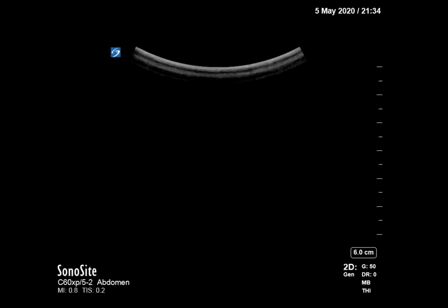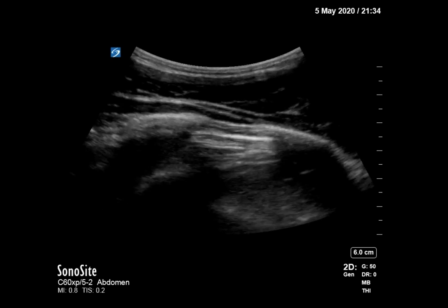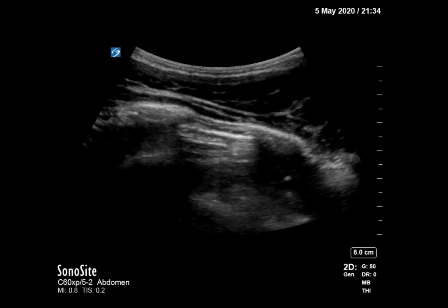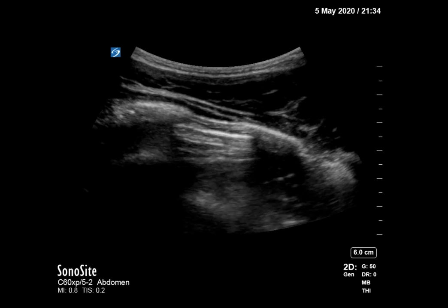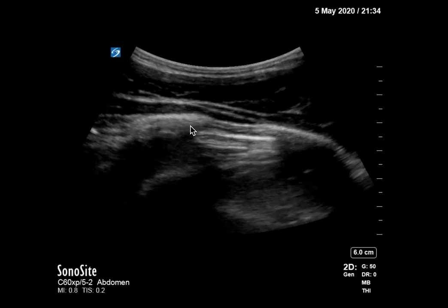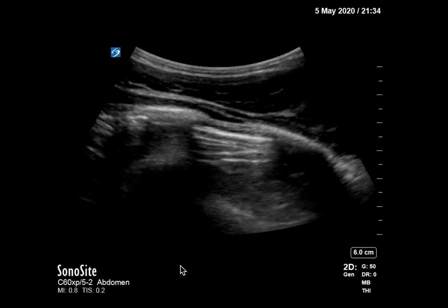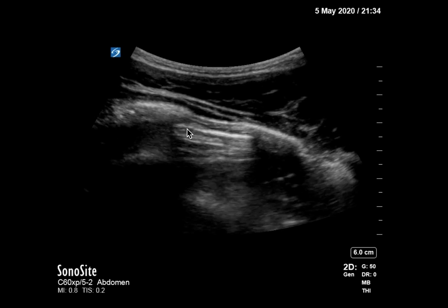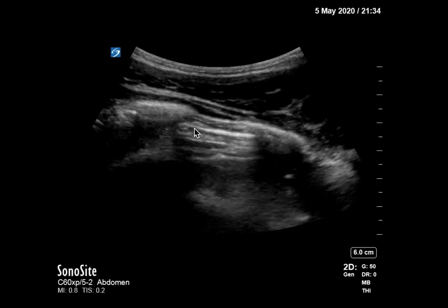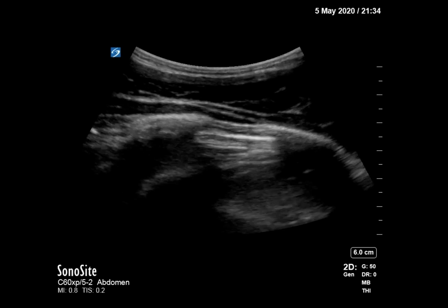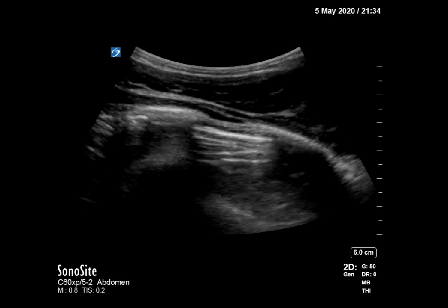Then we went up to the right side of the chest, looking in the midclavicular line about the second intercostal space. You can make out a rib right here and right here, and here is your pleural line in between. We don't see any lung sliding in that view.